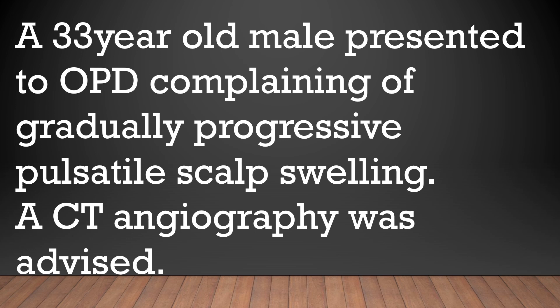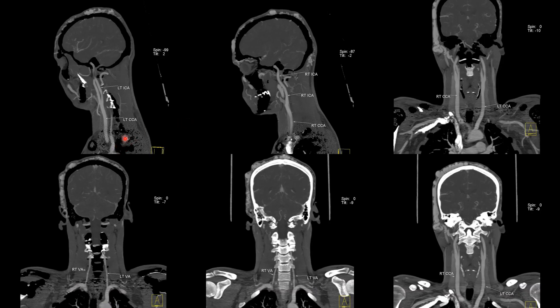A CT angiography was advised. In the first image we can see the left common carotid artery with its division. In the second image we can see the right common carotid artery with its division. In the third image we can see the coronal reformation of the right and left common carotid arteries. In the fourth image we can see the coronal reformation of the proximal segments of the right and left vertebral arteries. In the fifth image we can see the proximal as well as mid segments of the right and left vertebral arteries. In the sixth image we can again see the right and left common carotid arteries in the coronal plane.